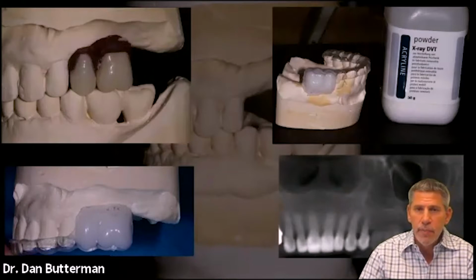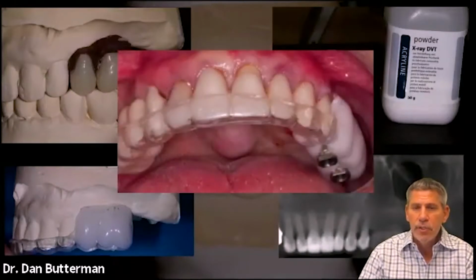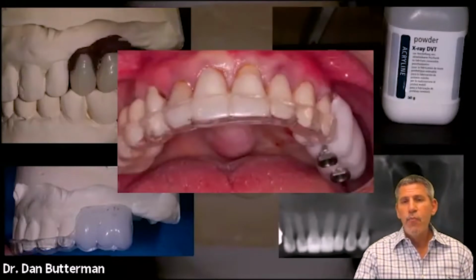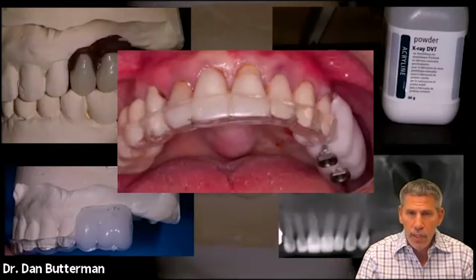So now you're planning your implants based on where your teeth are going to be. And you send all that back to the lab and you say, okay, go ahead and make me a surgical guide so I can get these implants where we plan. So by the time we get to this point, we have spent hundreds and hundreds of dollars. We have spent weeks and weeks of time. And really, is that necessary anymore?